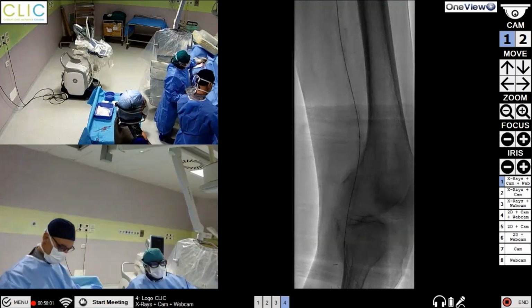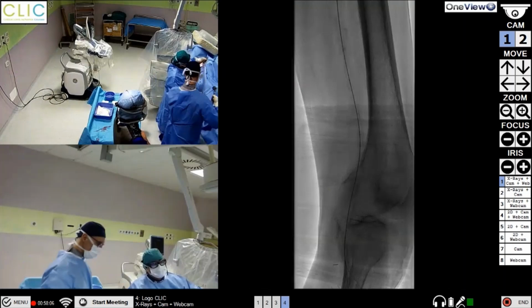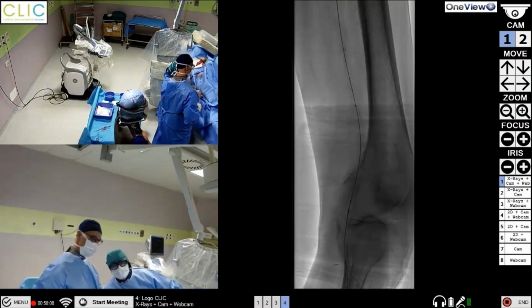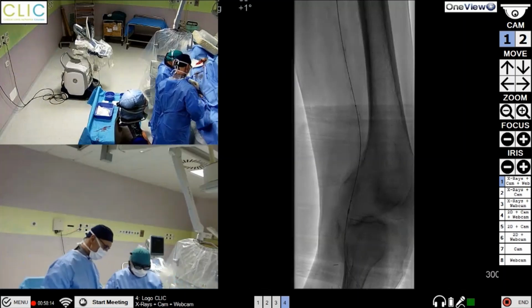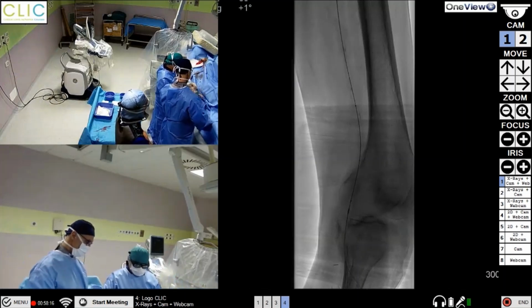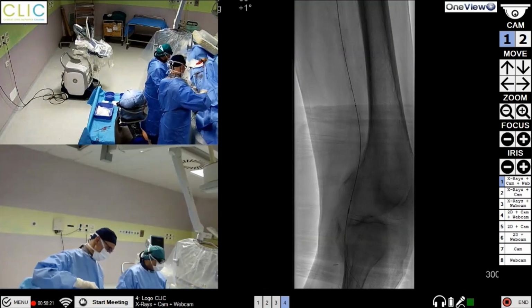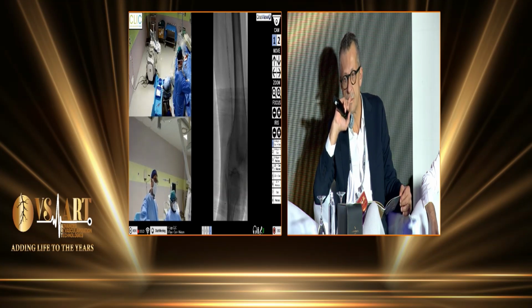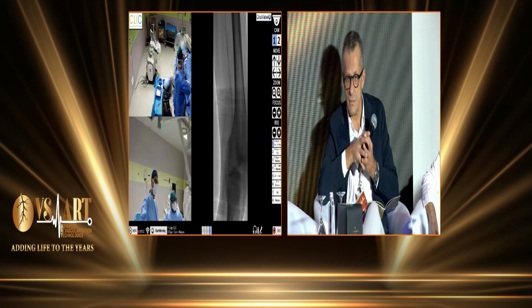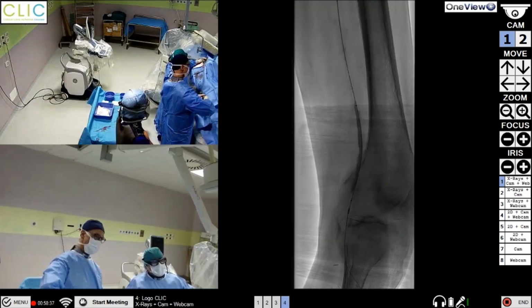Ciao Bruno. Just a question about the vessel prep, or how to treat this, a discussion. Why not use a scoring balloon or something different to prepare the vessel? Could be an idea, or is it better to go directly with the high pressure and then eventually the Supera stent? Sure, Bruno. The scoring balloon or a focus force balloon could be a very good option.